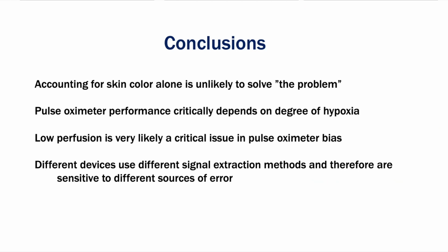And furthermore, different devices, because they handle low signals in different ways, produce different amounts of bias under different conditions. And I think that's an important point for the consideration of using reference devices in validation studies, because under challenging conditions, the performance of even a validated reference device might vary. And I think that's something that the committee will need to consider.